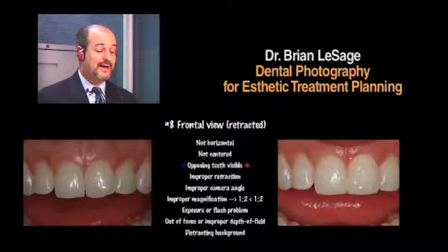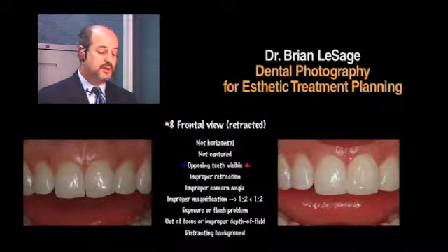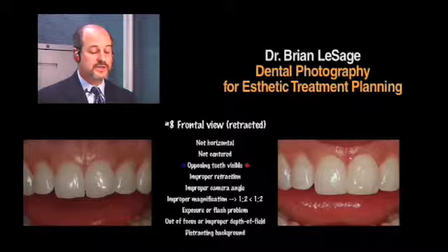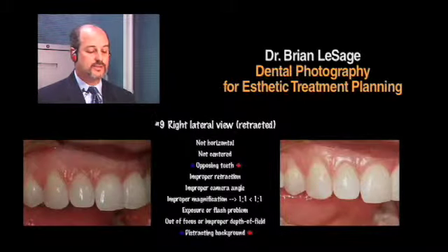But looking at the lateral views, as I've mentioned several times, the lateral will split the X and Y plane. Now I like the position of this incisal edge. It's in maybe the lower third line, if you will, okay? It splits it into lower third. So I like that position. If there were any diastemas between the lateral and the adjacent teeth, you'd be able to see right between those. So that's the angle that I like to shoot this at. The lateral splits the X and Y plane, and certainly the lower half, closer to the lower third, is where I'd like the incisal plane.